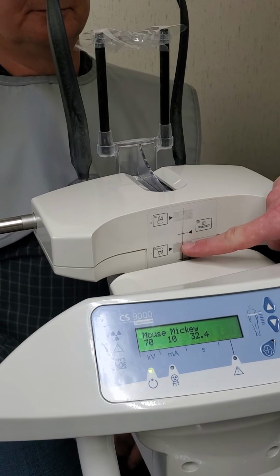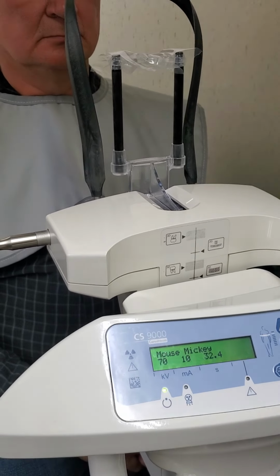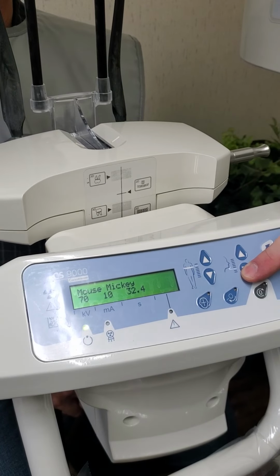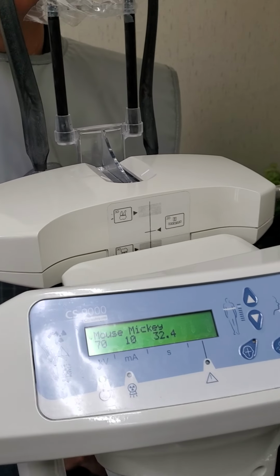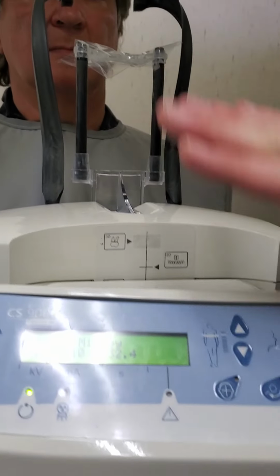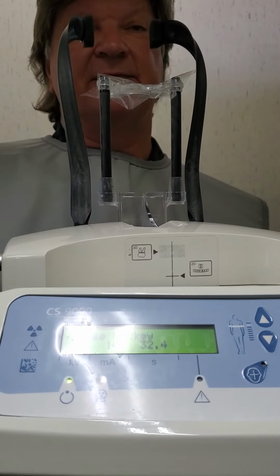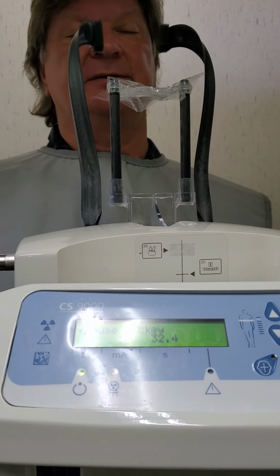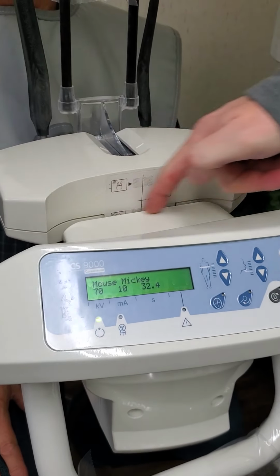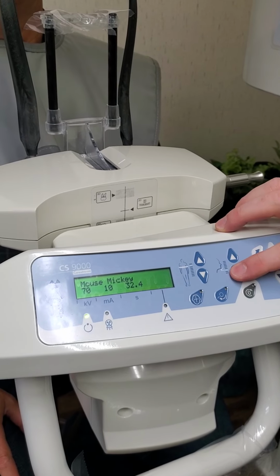If we're going to be doing a lower tooth or a lower quadrant or arch, we want to adjust the chin rest to the point where it covers up, and you want to get down level. Guys, right now take your camera and go level, because it looks different when you get level. If you sit up above, you get a different reading. Okay. So if you come level with this surface here, you'll see that it covers up all of the dots for the lower.